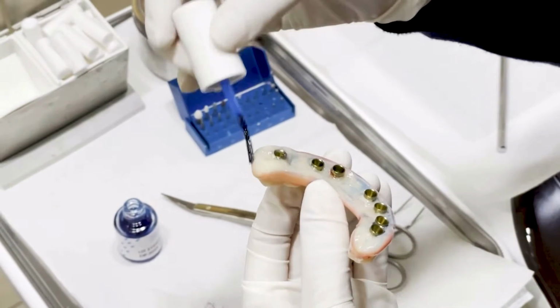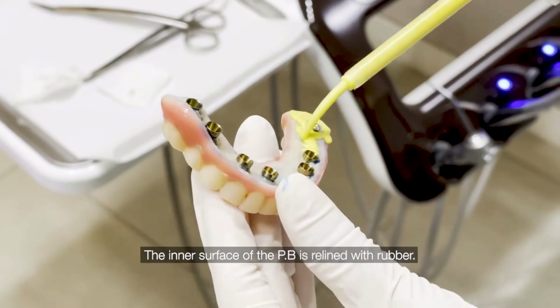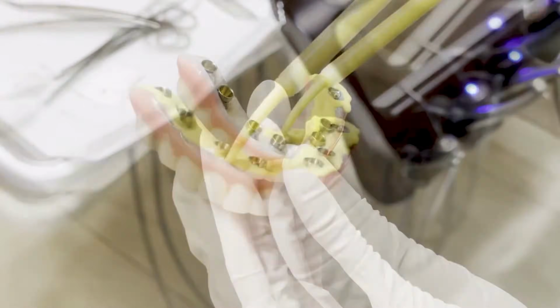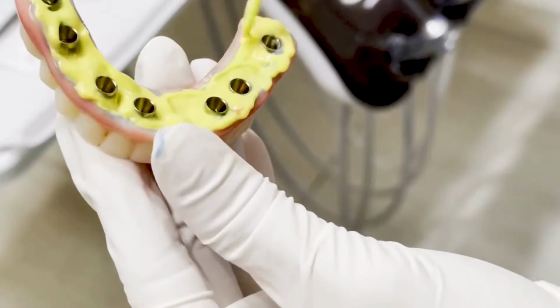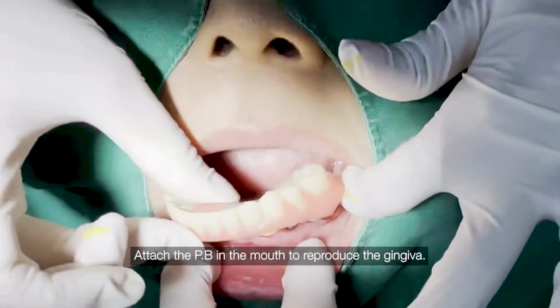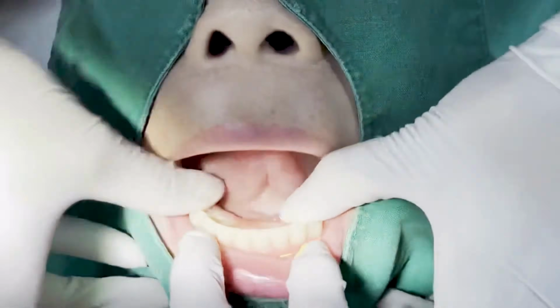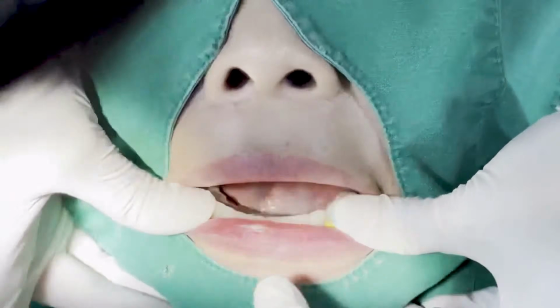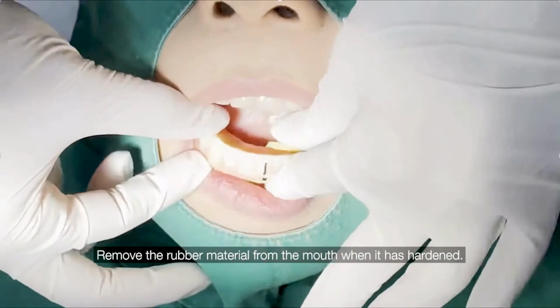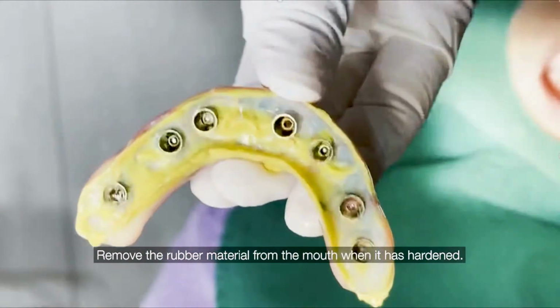To design the final restoration. Accuracy: digital scan bodies provide high precision, often around 20 to 40 microns, while photogrammetry systems can reach extremely high precision, close to 2 microns. Both technologies help us capture the implant position accurately for predictable restorations.